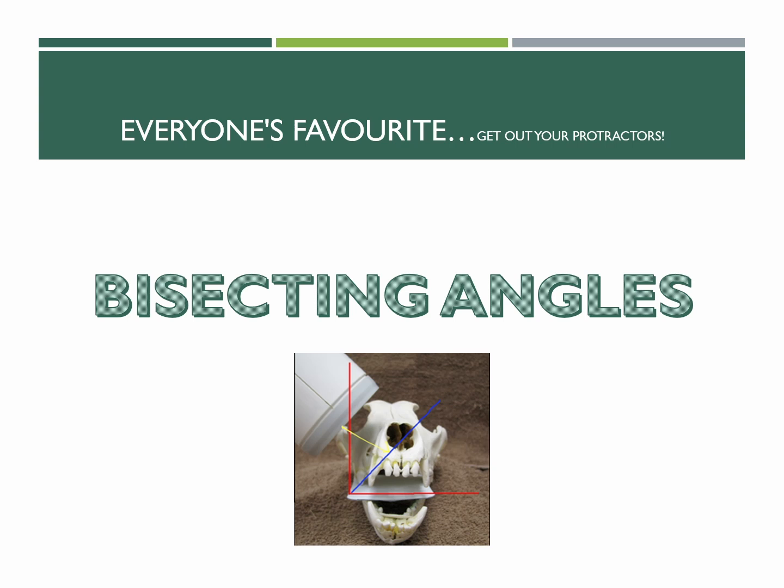Right? X-rays are always a bit about tweaking, even parallel. Sometimes you're coming at it not quite directly, so you elongate, or you're looking kind of down the front or the back of the teeth. But it's usually just a little bit of tweaking. But if you set this up perfectly, you're going to see the whole root, and you're going to see the crown, and you're going to get the shot you need.